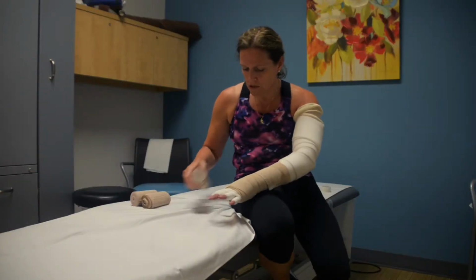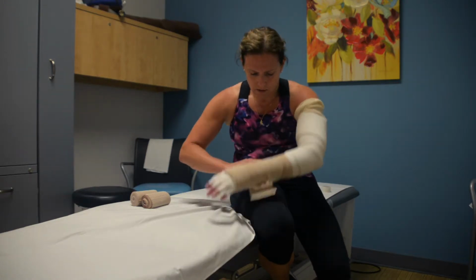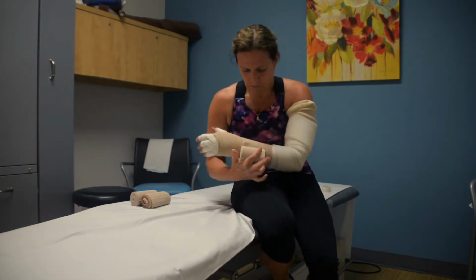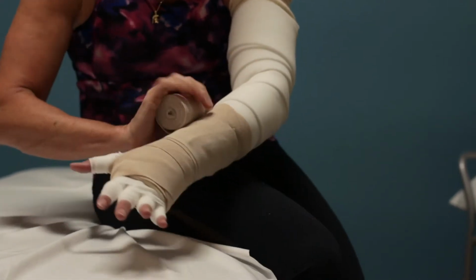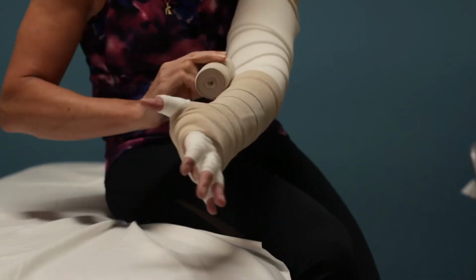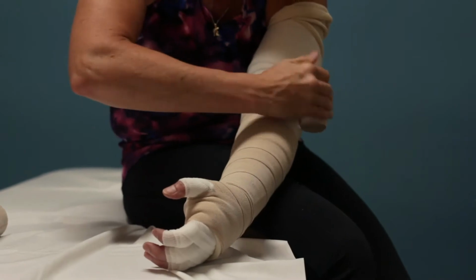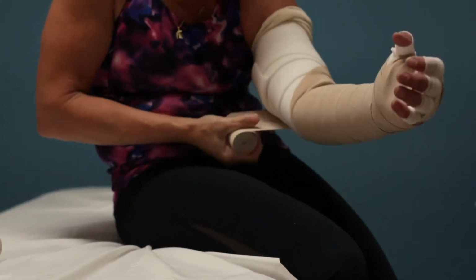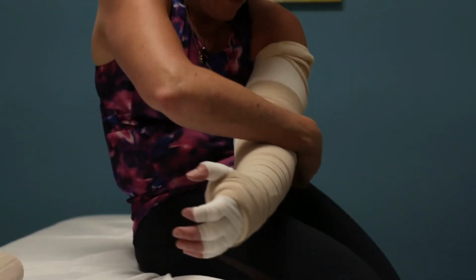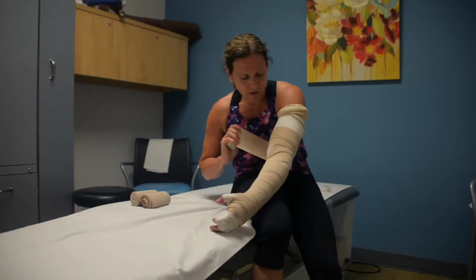Your second bandage is going to start at the wrist. So we're going to anchor it at the wrist. Second bandage, you're actually going to start up your arm now. Overlapping about halfway. Once we get to the elbow, it's a sharp spiraling angle upwards, all the way around your upper arm. And then, so about really 1.5 times around the upper arm, then you're going to come back down.